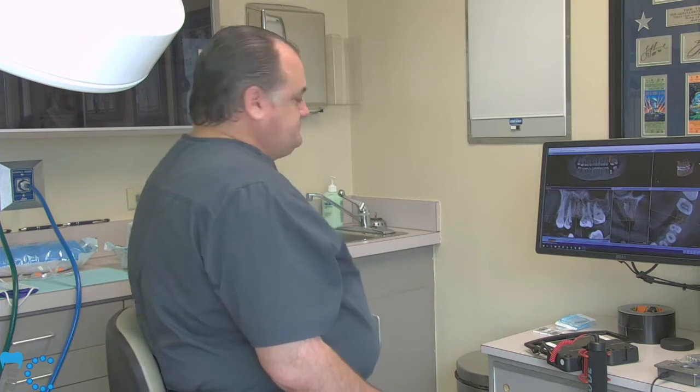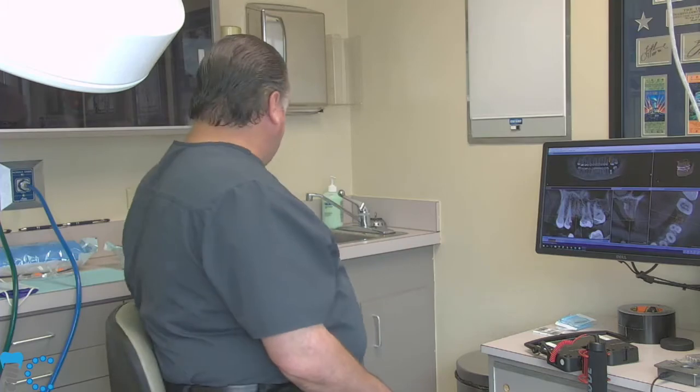Perfect. Thank you, Dr. Fields. I think the patient's here, and we're about to anesthetize the patient and get started. All right, let's do it.